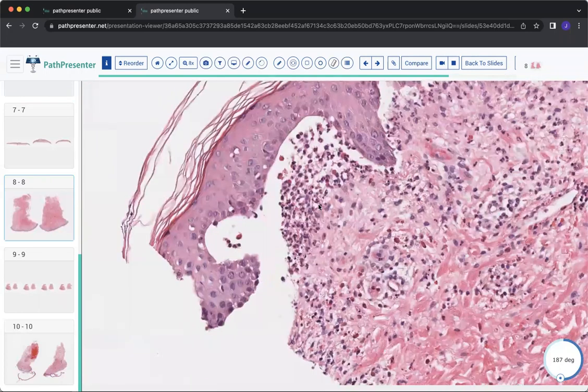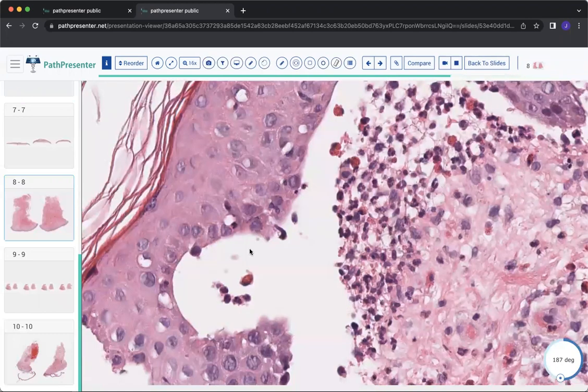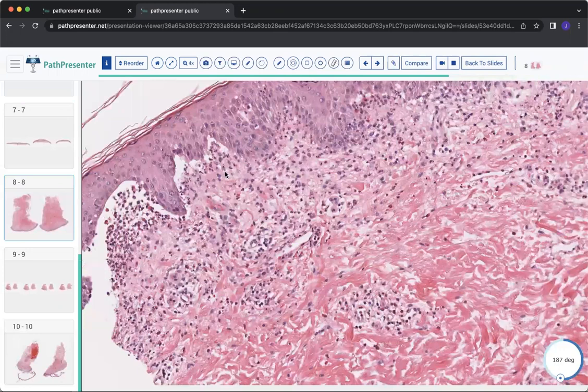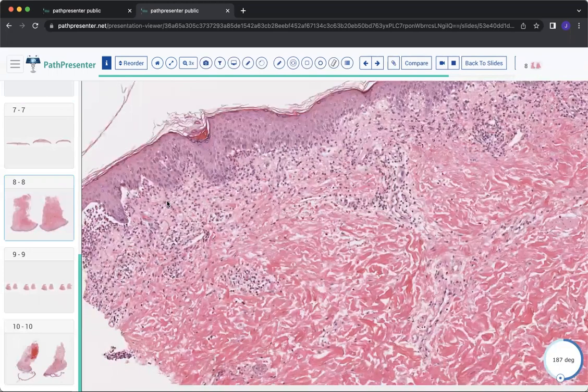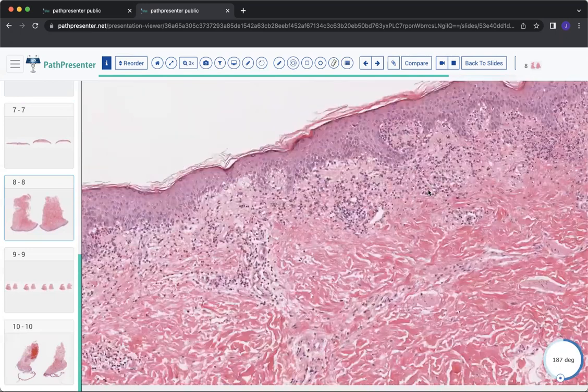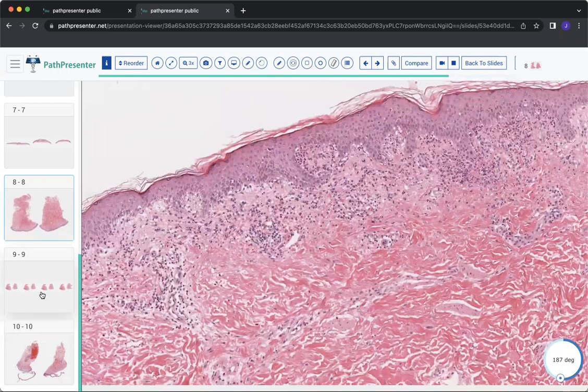So this is pretty freshly detached epithelium, because the keratinocytes still look very healthy and viable in many ways relative to other examples that we've seen. So that is linear IgA bullous dermatosis. And you should contrast that to dermatitis herpetiformis.